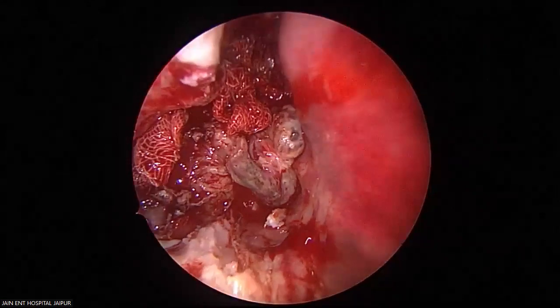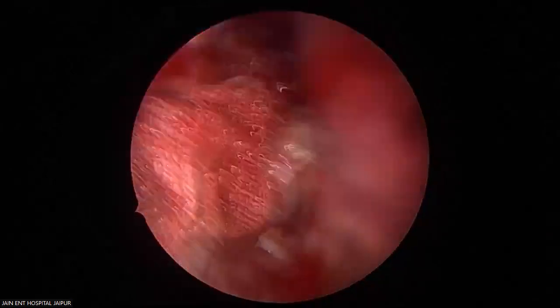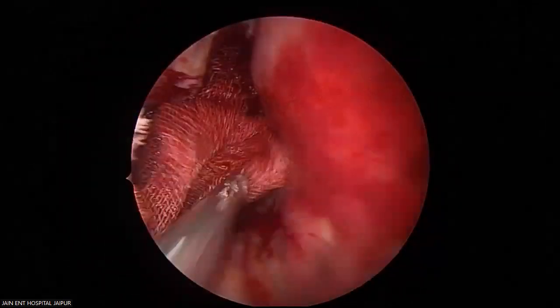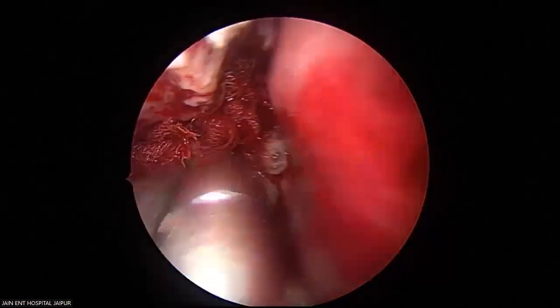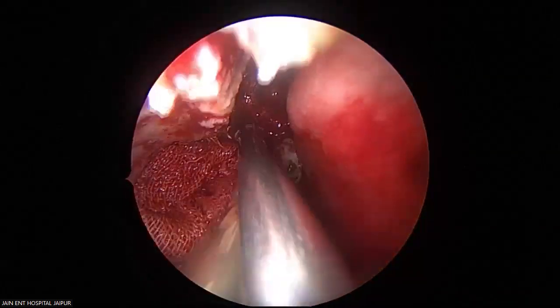Give me a pack, small pack. See the tumor exposed from so many sides. Now I will go medial to it. We need to have a full exposure all around when we pull it. See this? Now medial exposure.